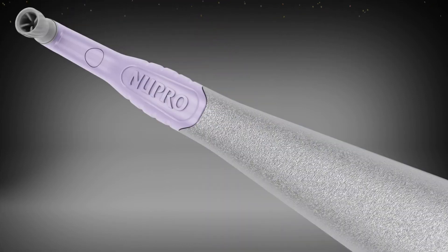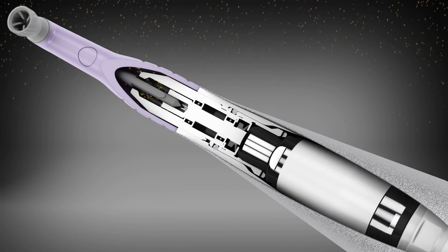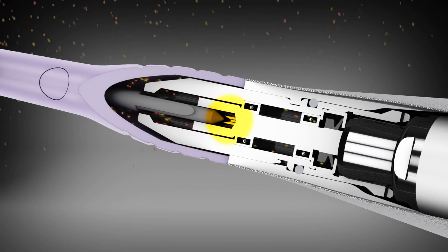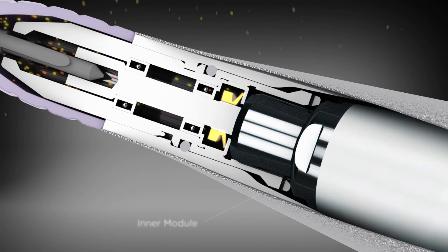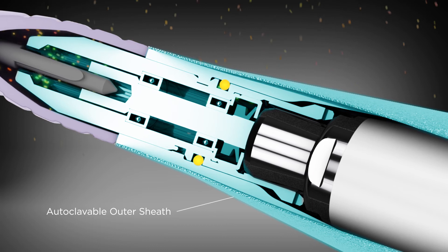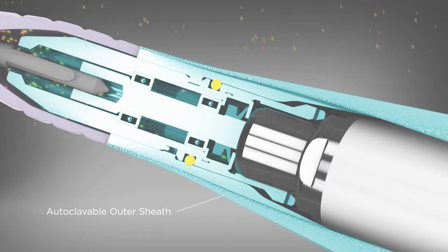Dentsply Sirona engineered specific controls to avoid contamination into the Nupro Freedom inner module, including a sealed coupling shaft which connects to the profi angle on the outer sheath, and a separate second coupling mechanism inside the sheath which connects to the inner module. The fluid seal on the Nupro Freedom's autoclavable outer sheath isolates the inner module from patient fluid and provides a secure infection control barrier.